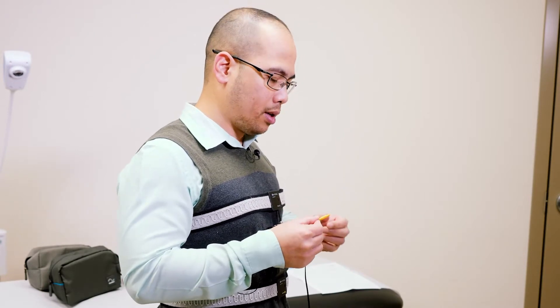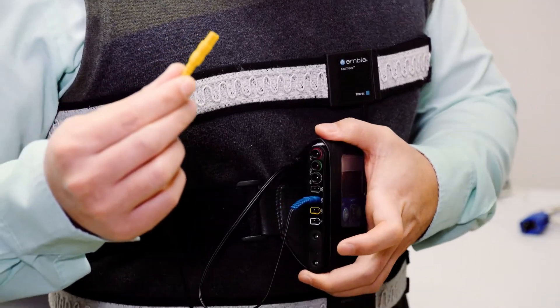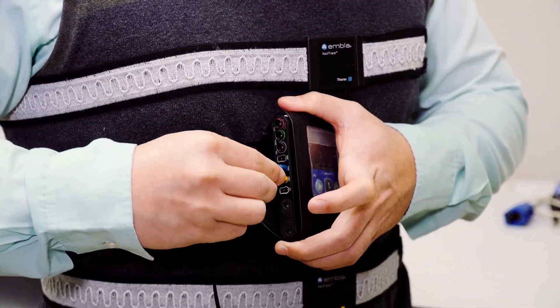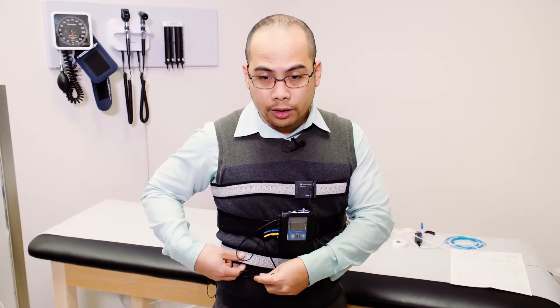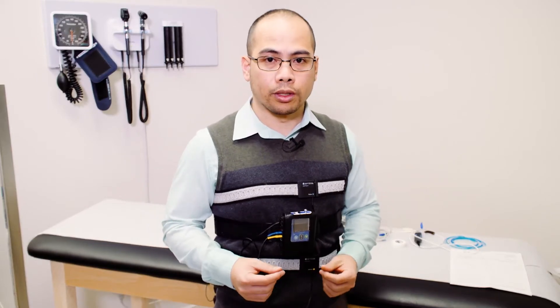Same thing goes for the belly sensor connection — it's color-coded yellow, and the point of attachment is on the side of the recorder on the yellow port. Just slip it in place. The rest of the wires you can just tuck underneath the sensors so that they're not all over the place.